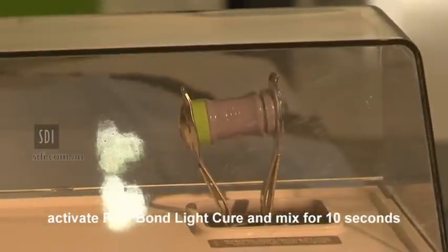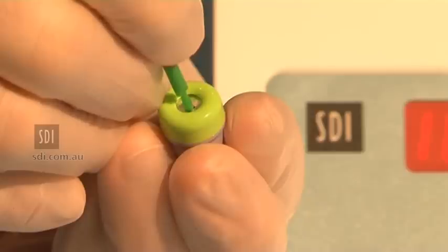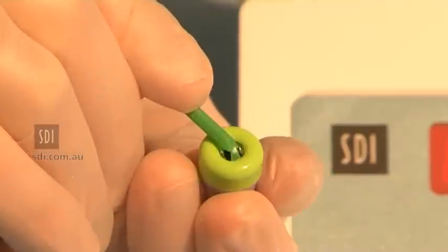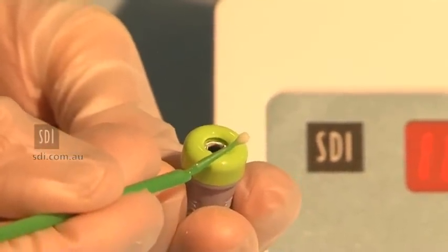Activate RevaBond LC capsule and mix for 10 seconds. Pierce the foil cover of the RevaBond LC reservoir using the supplied brush. Rotate the brush to push the foil to the sides of the reservoir. Bend over the brush and remove the brush from the reservoir.